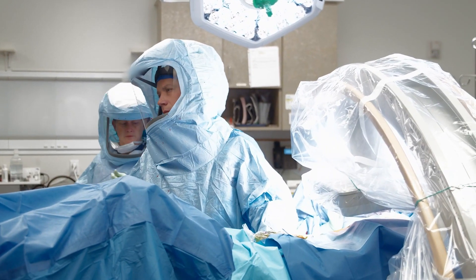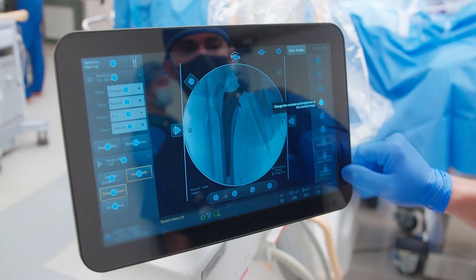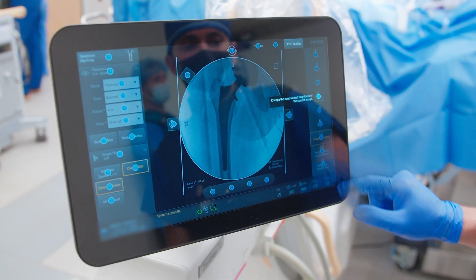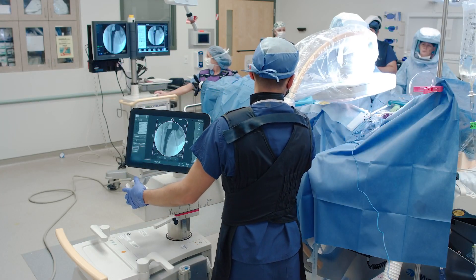I can focus on what I'm doing without having to direct the image capture, because the ease of the interface makes it so that pretty much anybody who has come into my operating room can immediately access the C-arm, direct the C-arm, utilize the C-arm, and does not need a lot of added direction.